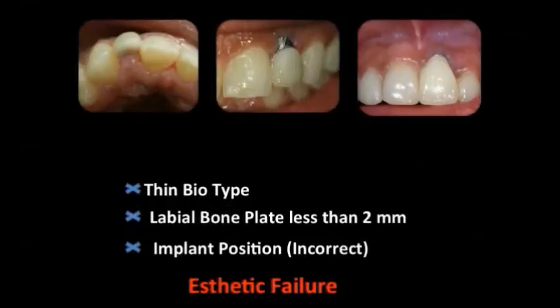If you look at this case, this case also came to me at the clinic. Some cases were done by colleagues, and they referred the case to me to ask what they can do. In the top case here, this is a lady in her 20s. She just graduated from dental school. She asked her colleague to do an implant on her. The colleague did the implant, as you can see, too buccally.